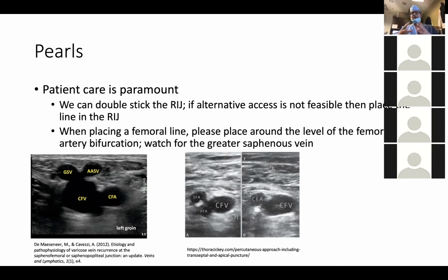That's important because at this level, you're above roughly the femoral neck and you can easily apply pressure. Those of you who do pain medicine, those of you who have done time in the cath lab may say that's not always true and vessel anatomy can vary. Without fluoro, you don't know. You're correct, but in these patients, we're not going to have fluoroscopy. So you're going to have to rely on the ultrasound best practice. And talking to our interventional cardiologist, that's our recommendation.